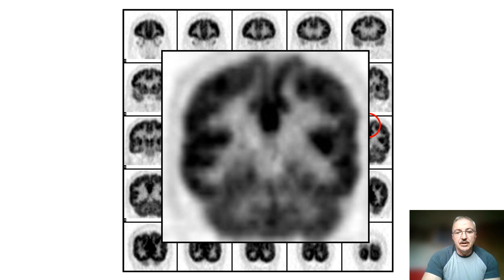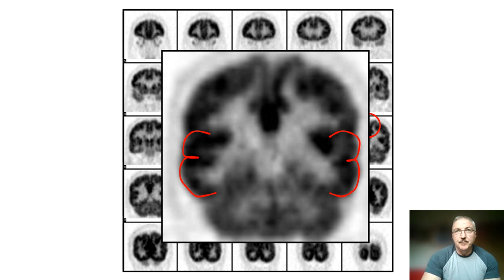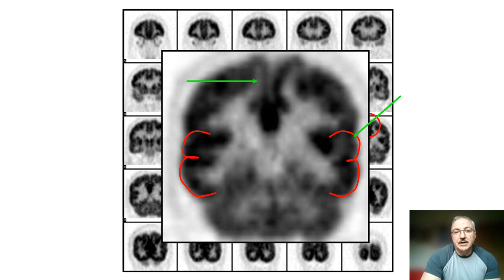Another nice pattern to recognize in the posterior and middle third of the lateral temporal lobe on the coronals is the epsilon-3 pattern — the intensity as it projects over the superior, middle, and inferior temporal lobe gyri. On this case we have reduced activity in the left superior temporal lobe gyrus and comparatively reduced activity within the right precuneus region. This is not a diagnostic pattern, but we would note these things.